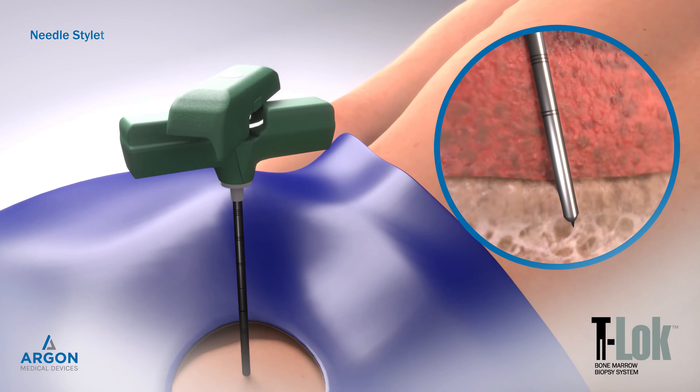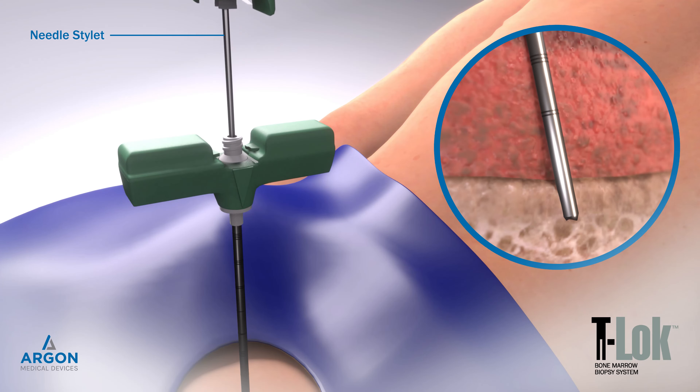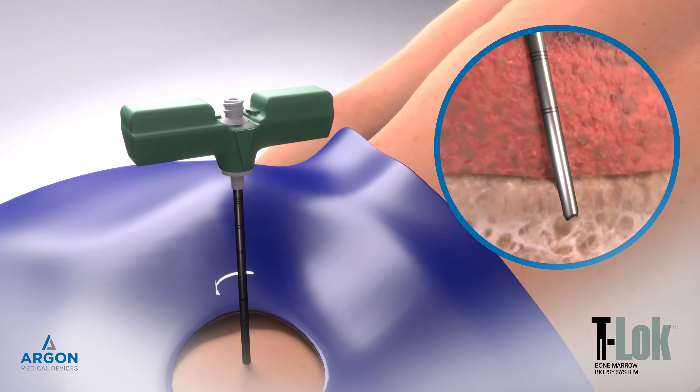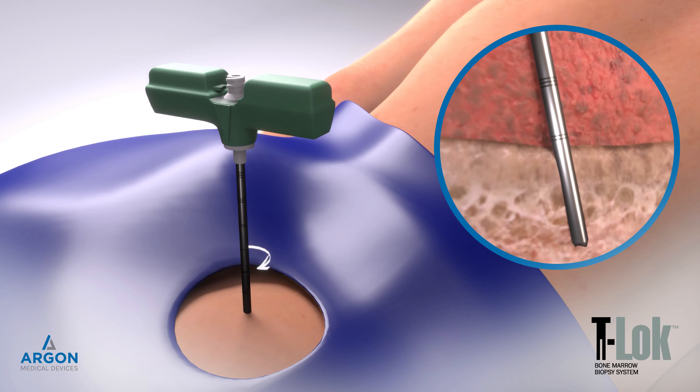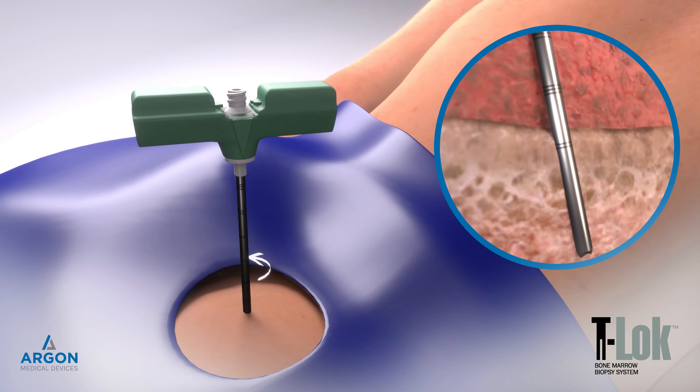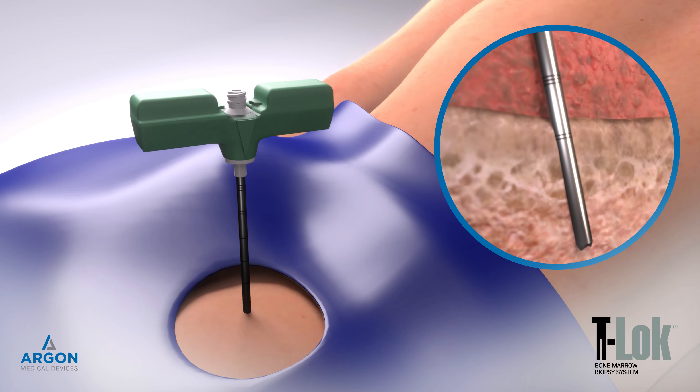Remove the stylet from the needle cannula by rotating the upper section 90 degrees and pulling straight out. Continue advancing the needle cannula forward 2-3 cm while rotating in a clockwise-counterclockwise motion into the bone marrow. Decreased resistance indicates entrance into the bone marrow cavity.